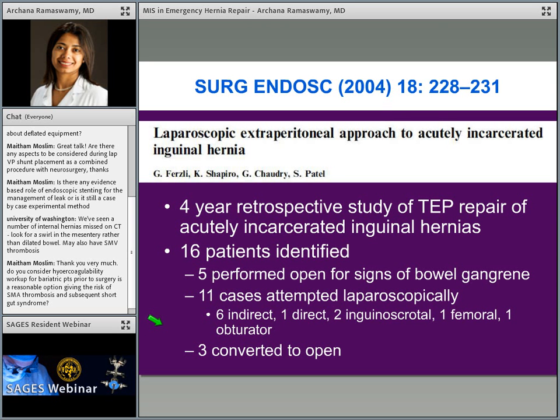Well, I guess it's buffering again, so maybe it will show it to us. So there, okay, so that one had viable bowel. Now this one is another video of a patient where this was previously placed mesh, very similar presentation in terms of an incarcerated hernia, again, in a morbidly obese patient.